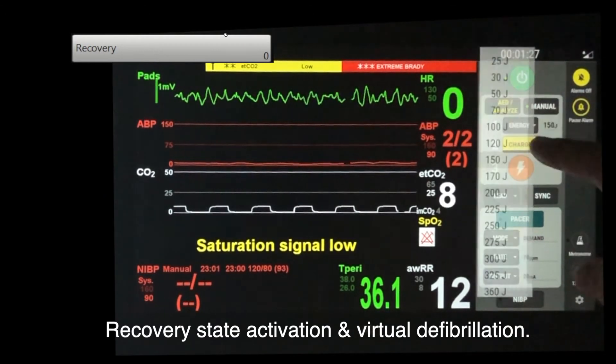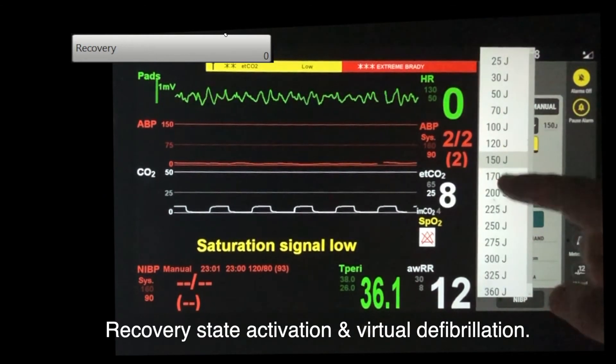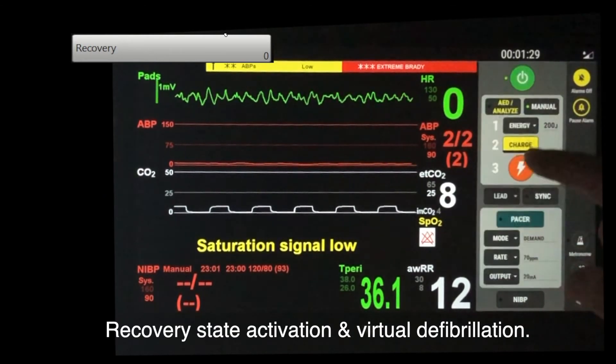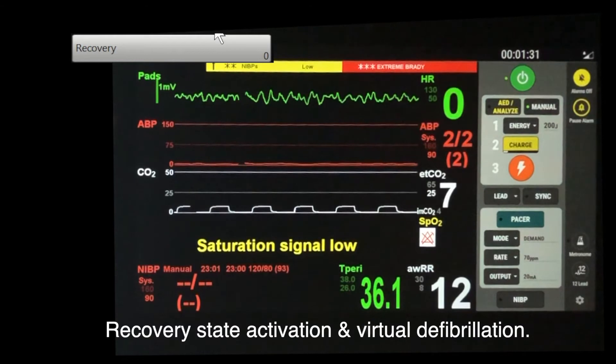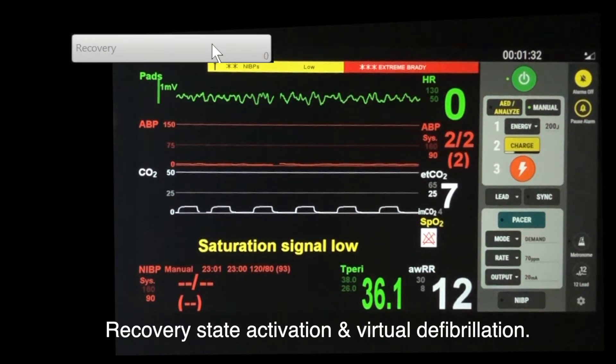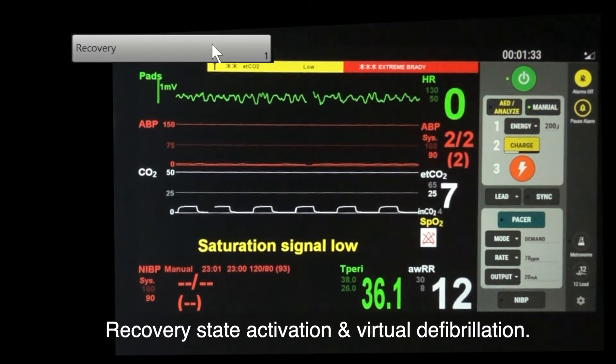In the ventricular fibrillation, the learner delivered a 200-joule defibrillation. VF is terminated with a flat line.